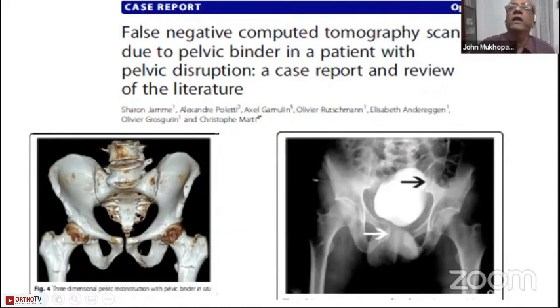And also more recently they've looked at mathematical equations. Okay, so take home: pelvic injuries can be serious life-threatening injuries. I think the classification should indicate severity of instability in these injuries and should also guide you on the management of these injuries. And of course, the role of CT is important in assessing the nature of these injuries completely.